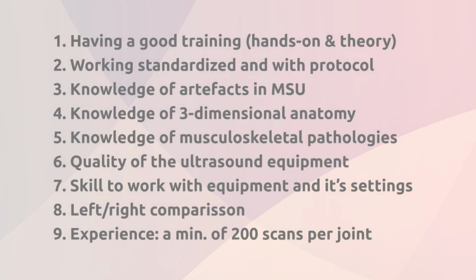MSU comes with a high general diagnostic value, equal to MRI. The high diagnostic value of ultrasound is strictly related to a few important criteria. MSU's diagnostic accuracy is not profession dependent, but user dependent. Anybody can do it as long as they fit the criteria described on this slide.